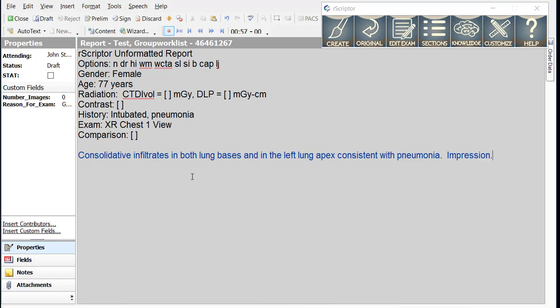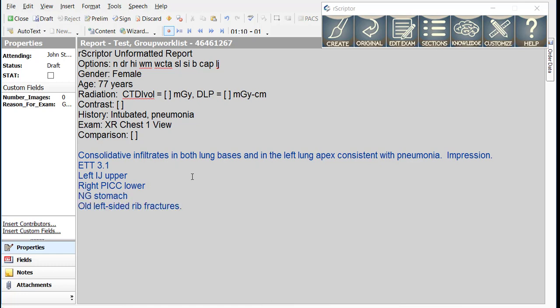Consolidative infiltrates in both lung bases and in the left lung apex consistent with pneumonia period impression period. Next line, ETT 3.1. Next line, left IJ upper. Next line, right PICC lower. Next line, NG stomach. Next line, old left-sided rib fractures period. Next line.